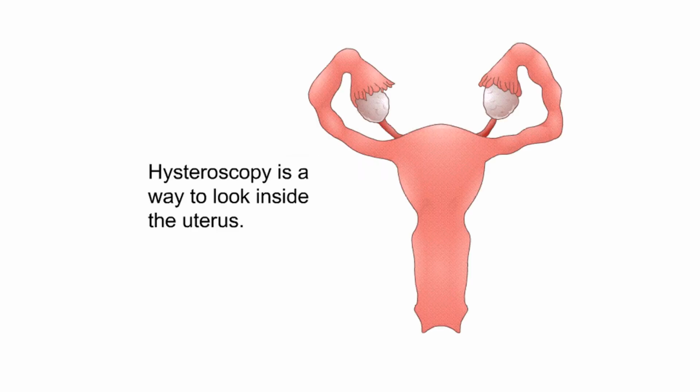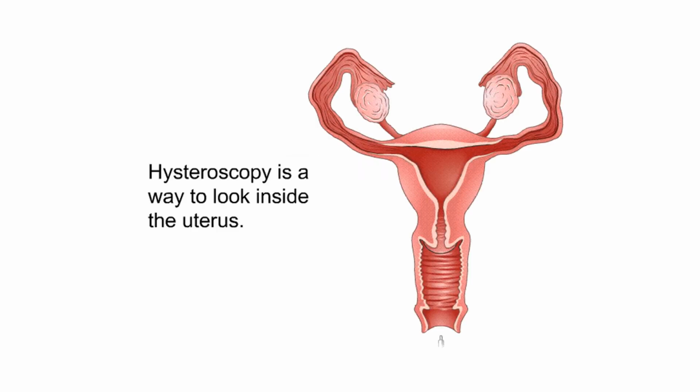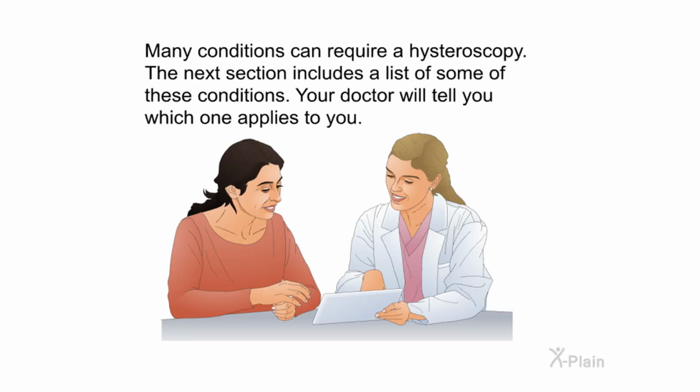Indications. Hysteroscopy is a way to look inside the uterus. Many conditions can require a hysteroscopy. The next section includes a list of some of these conditions. Your doctor will tell you which one applies to you.